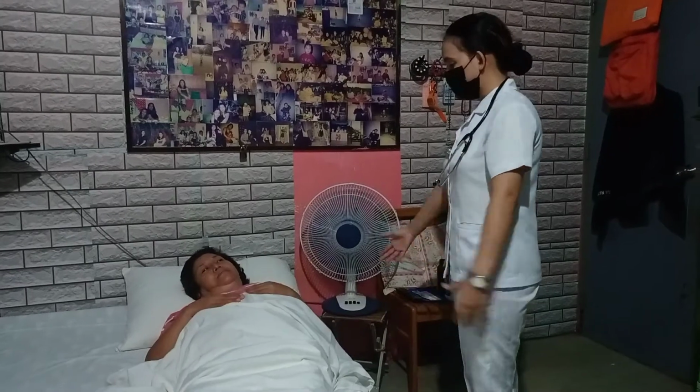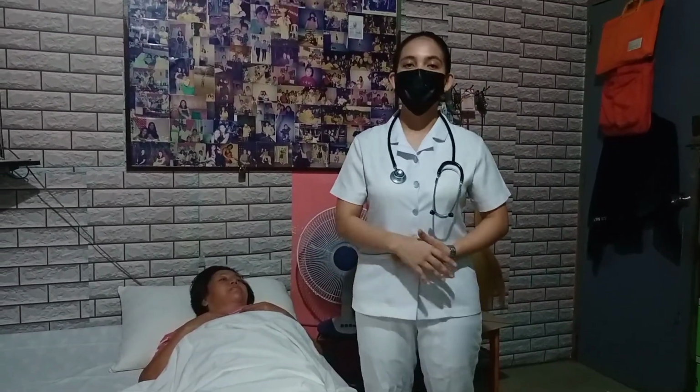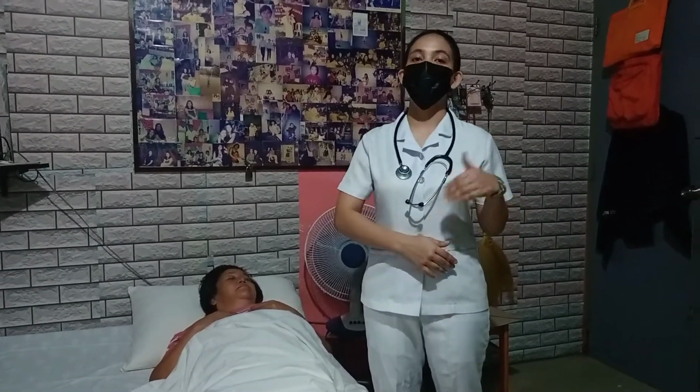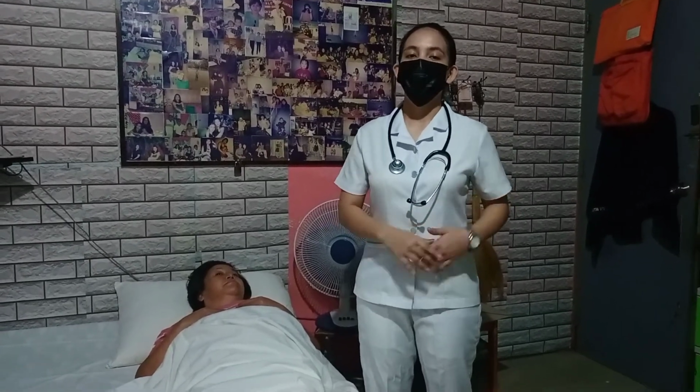Only a supine position. Okay. Asking your patient or helping your patient into a comfortable position is so that your patient would be relaxed and more comfortable to participate. Since we are in a pandemic right now, I am not allowed to inject a real person. So now I'm going to use an eggplant as my patient where I could do the intramuscular injection.